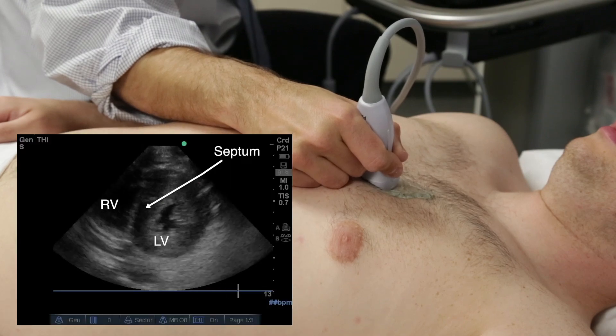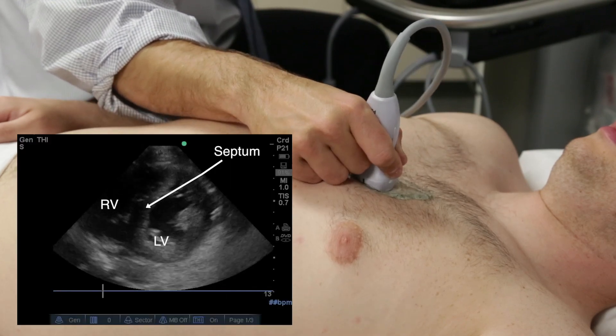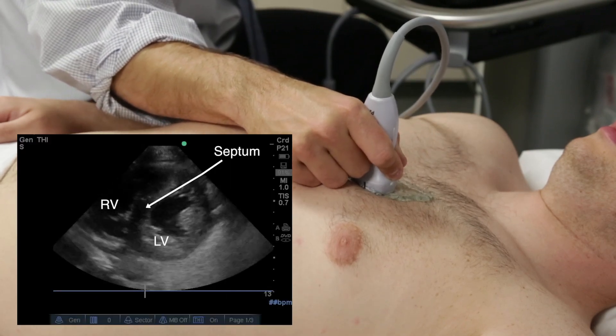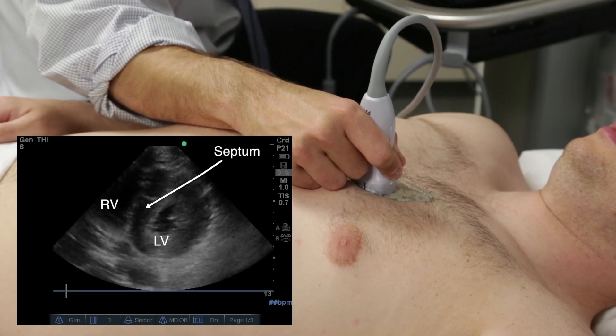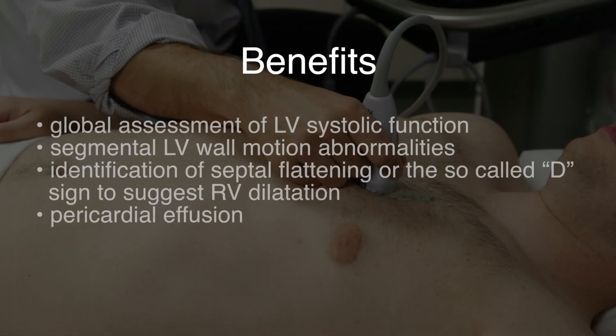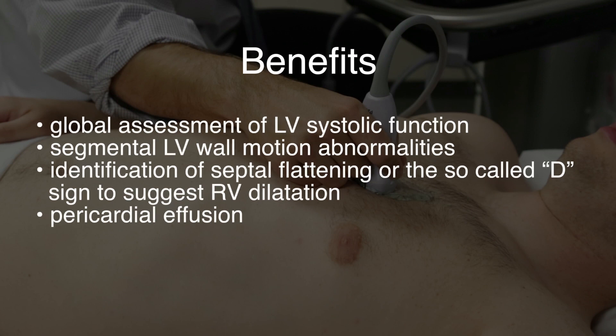The home base of the parasternal short axis view is typically at the mid-ventricular level where the left ventricle, right ventricle, and septum are easily identifiable. Once the parasternal short axis view is obtained, the provider may tilt the probe so that the ultrasound beam scans from apex to the base, bringing into view different imaging planes. Benefits of the parasternal short axis view include a global assessment of LV systolic function, segmental left ventricle wall motion abnormalities, identification of the so-called D sign to suggest right ventricle dilatation, and pericardial effusions.